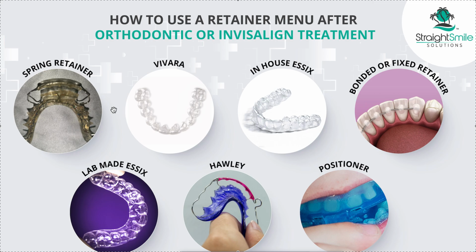Let's move on to a spring retainer. A spring retainer is kind of the great-great-grandfather to an aligner or Invisalign. The positioner is what we had back in the 60s, 70s, and 80s, before we had Invisalign, to make teeth straight, with our removable appliance. So these are still good retainers. Matter of fact, this is my retainer. I couldn't find a great stock image, and they're not made that commonly anymore, so I showed you mine.